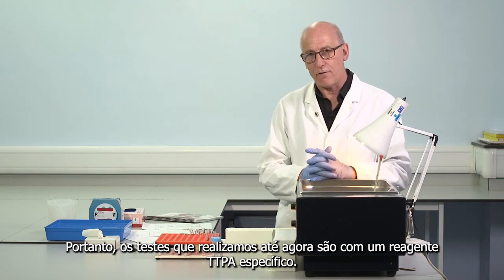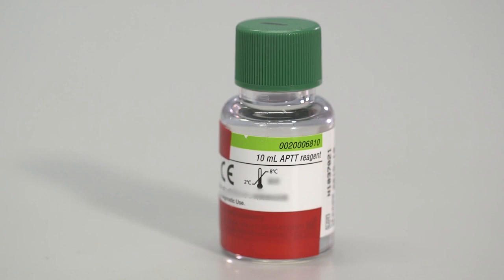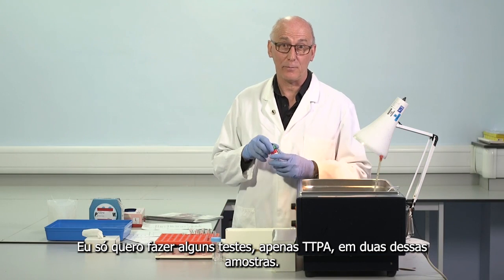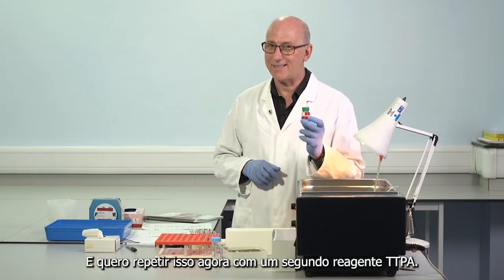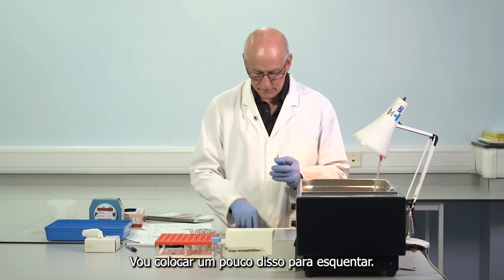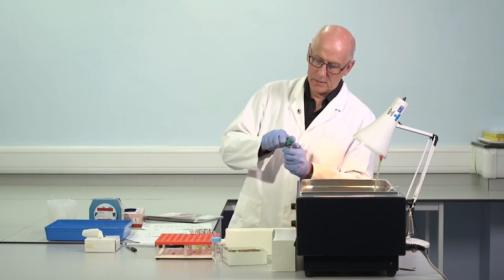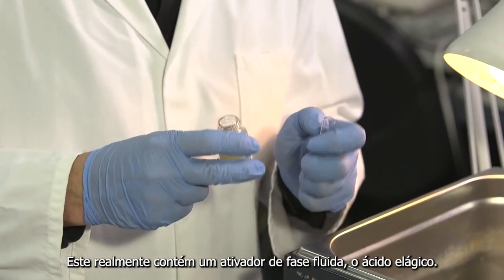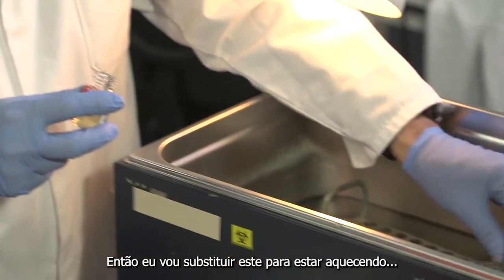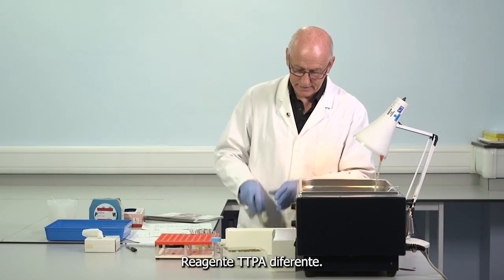So the tests we've performed so far are with one particular APTT reagent. I just want to do a couple of tests, just APTTs, on 2 of those samples. And I want to repeat that now with the second APTT reagent. So I'm going to put out some of this to be warming. This one actually contains a fluid phase activator, ellagic acid. So I'm going to replace this to be warming up with the first one. Different APTT reagent.